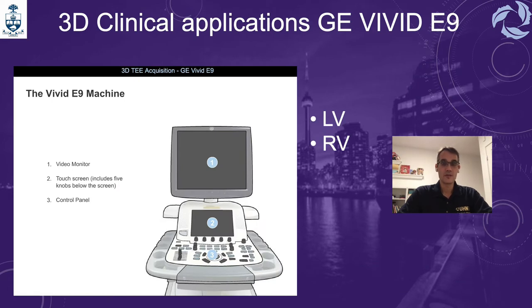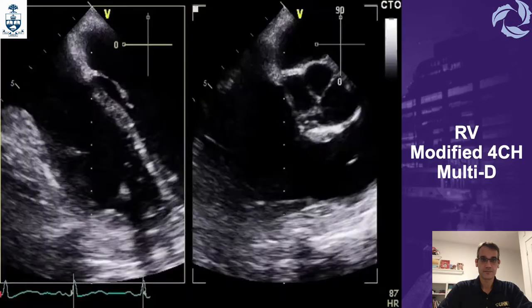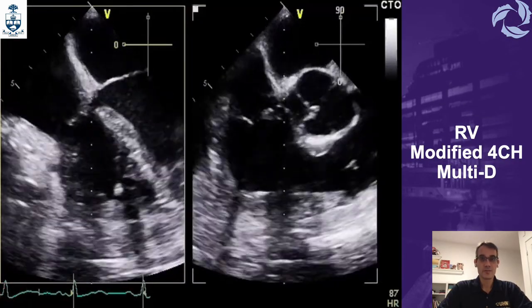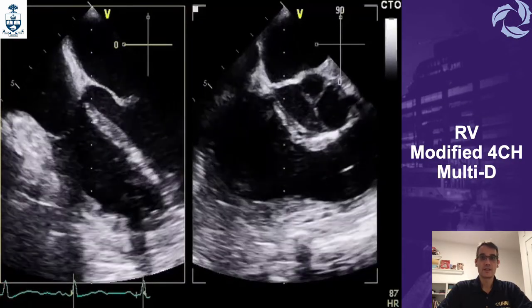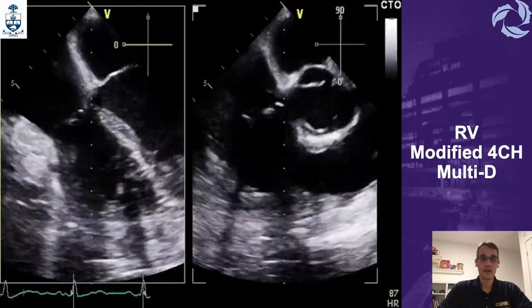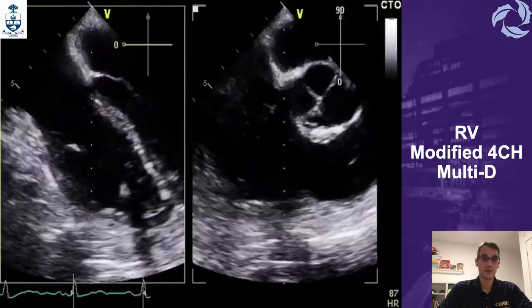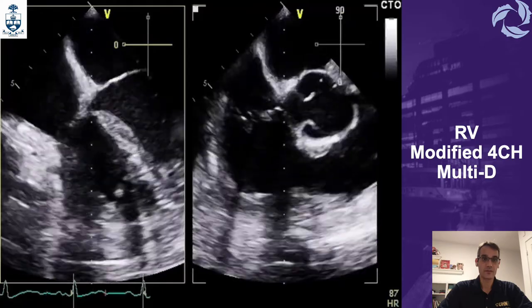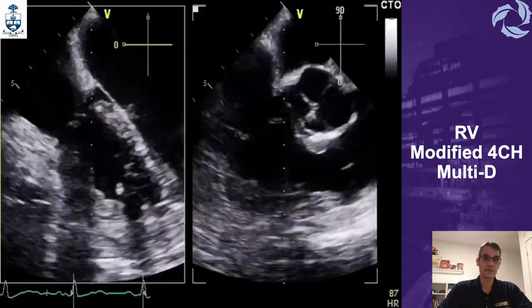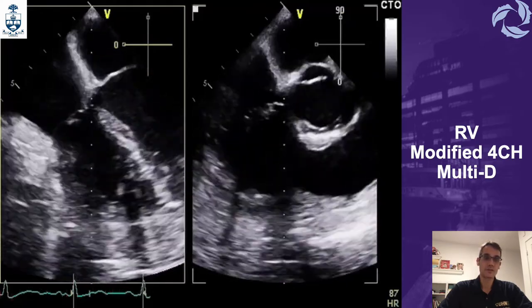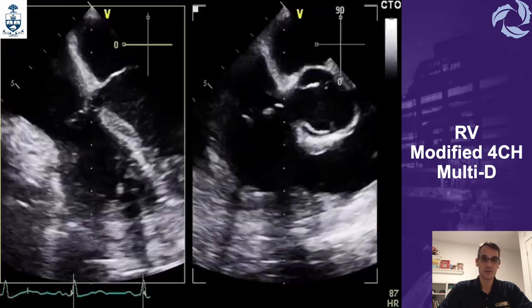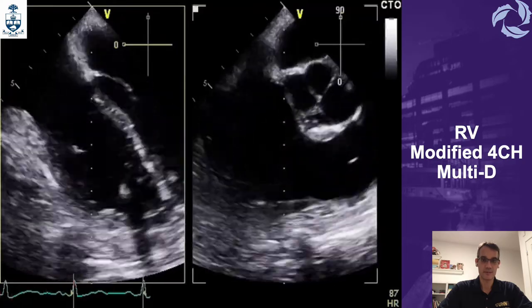Now we are going to do the same thing using the GE Vivid E9. Using Multi-D is going to be equivalent to X-Plane. In this example, we use it over the right ventricle, and we can simultaneously see the same walls that were assessed using X-Plane on the Philips.